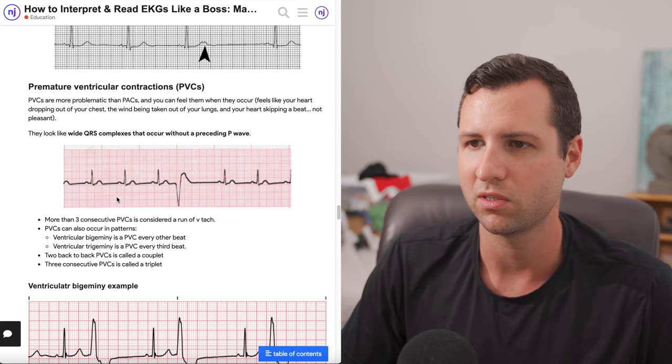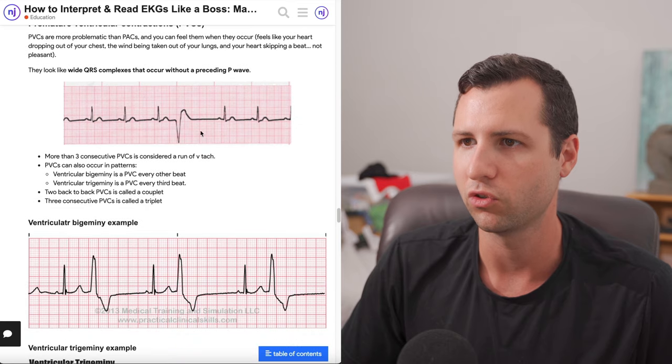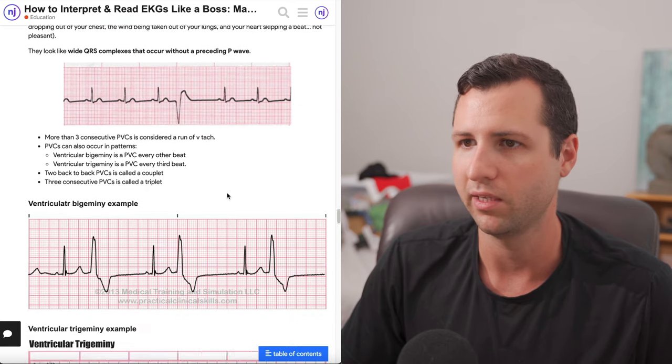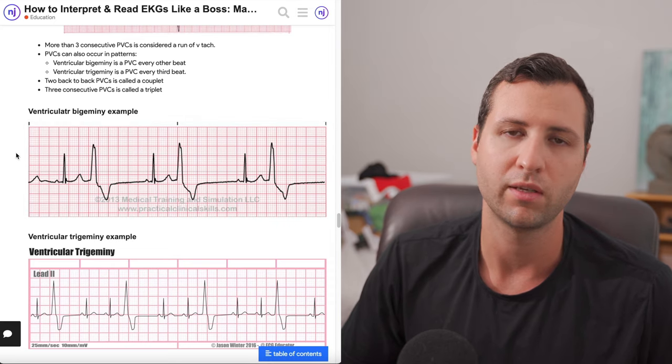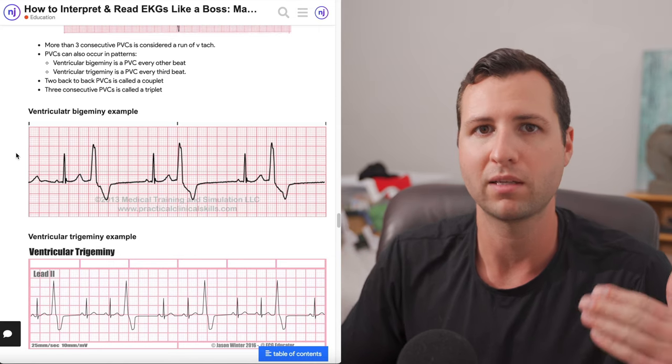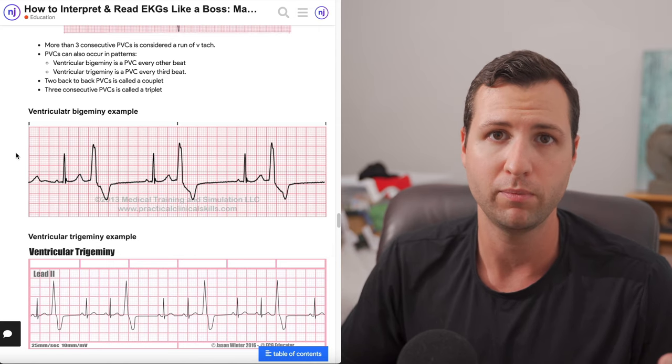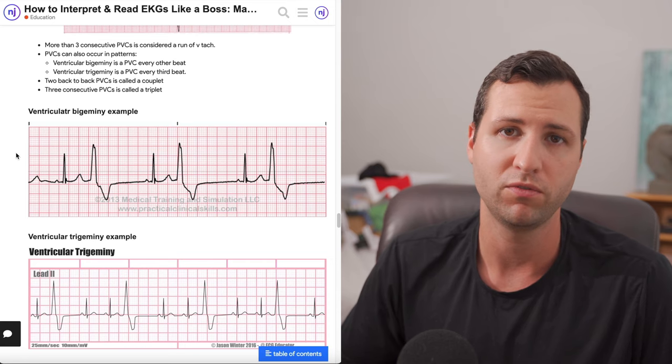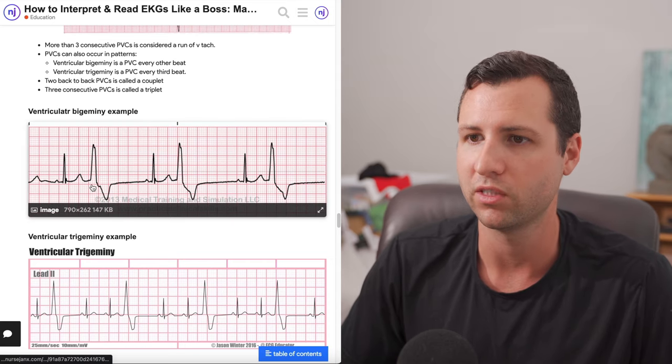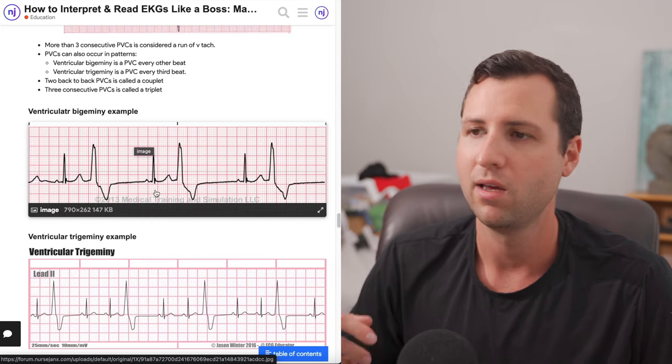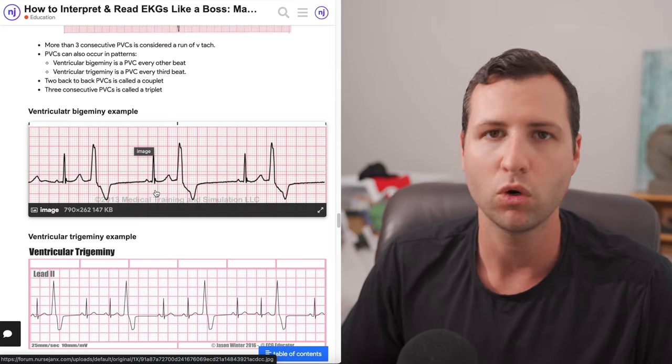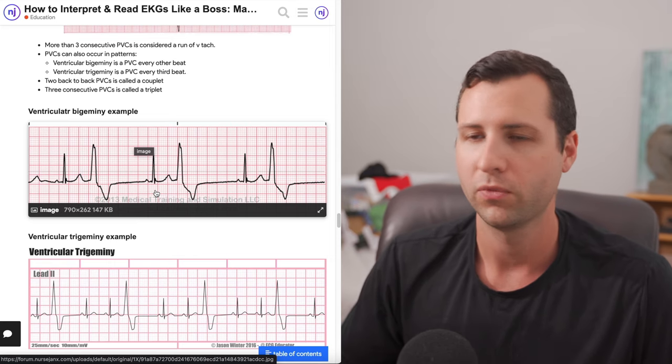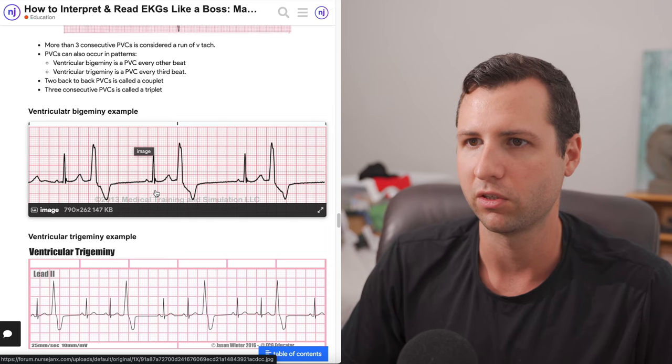It's really easy to see PVCs. PACs are a little sneaky sometimes to see. PVCs, pretty obvious. There's only one in this one here right now, and you guys can see it plain as day. If we go down here to look at some other examples, PVCs can occur in different patterns. They can occur as couplets, essentially two back-to-back. They can occur as triplets or three back-to-back. If you guys have four or more back-to-back, that's actually considered a run of V-tac.